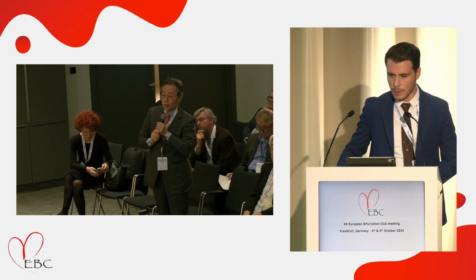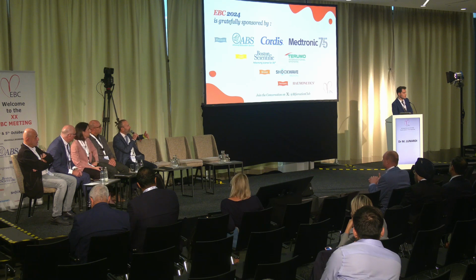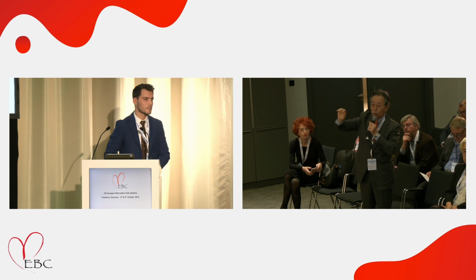I can show you maybe. Yes, it was the retraction because it was not corrected by the POT balloon, because the balloon can't reach that malapposition at the ostium. So when you use a long balloon, such kind of malapposition is likely to occur because of the straightening by the ballooning, which causes the retraction of the strut in the direction of the left main. So the LAD ostium malapposition is likely to occur at the opposite side of the LCX.